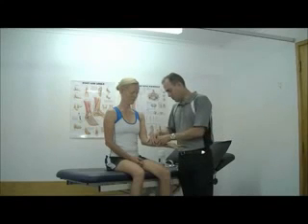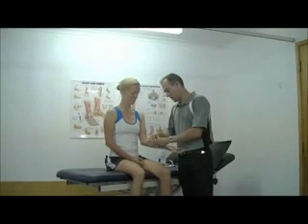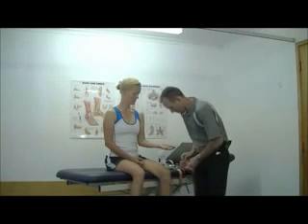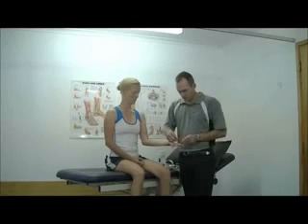If we wanted to use our kinesio and allow full movement, what we would have to do is apply it at the end of range, like so.